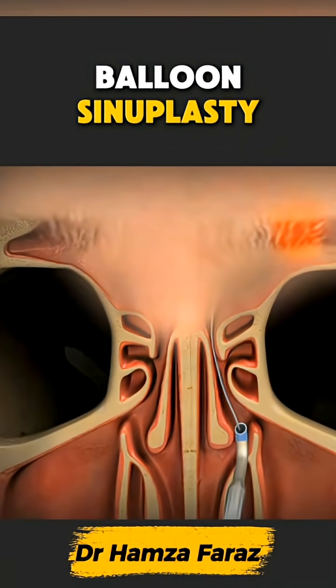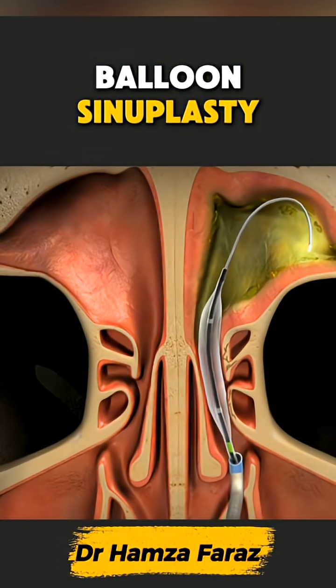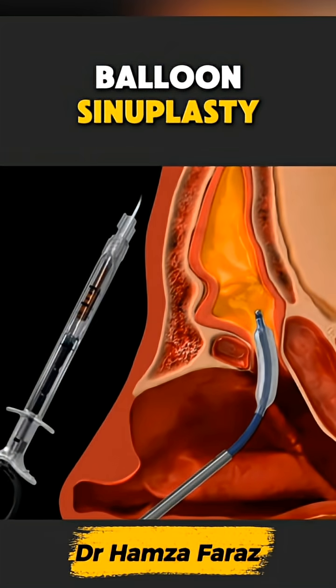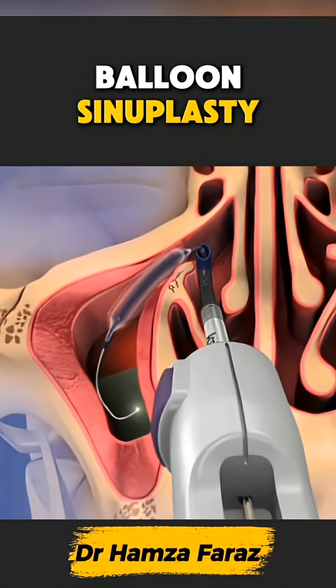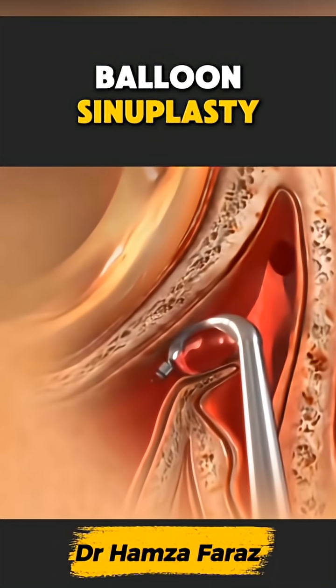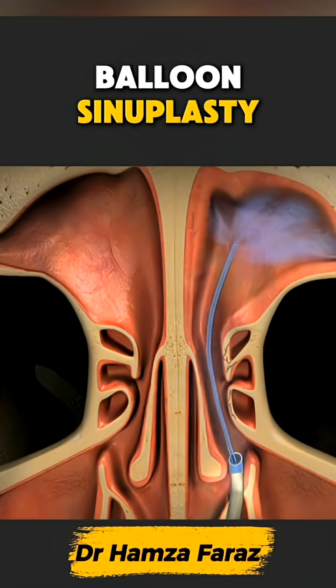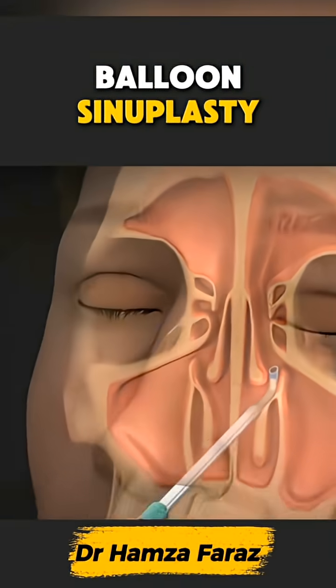Over this wire, a small medical balloon is slid into position. Once in place, the balloon is slowly inflated, pressing against the tight sinus walls and widening the narrow passage without cutting or removing tissue. This gentle expansion creates a clear pathway for mucus to drain and air to flow again.